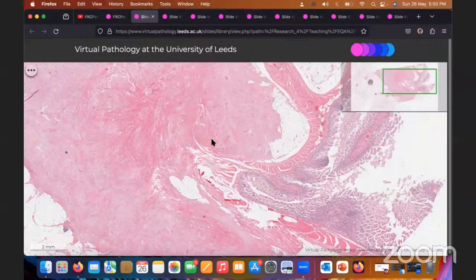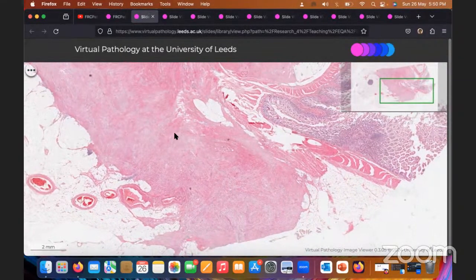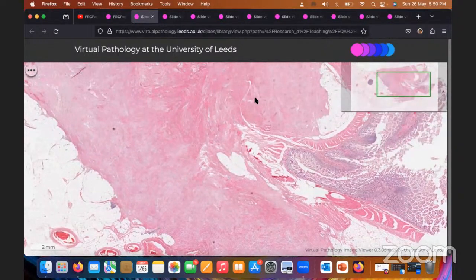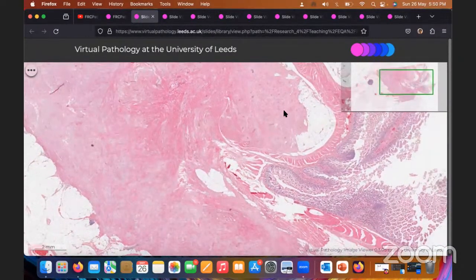So these are the few immunos you can take help of. And you can say that fibromatosis can be associated with some syndrome, mainly FAP. So whether there is any history of any colon cancer in the family, that can be screened. And this lesion, if it is completely excised, then it doesn't recur.